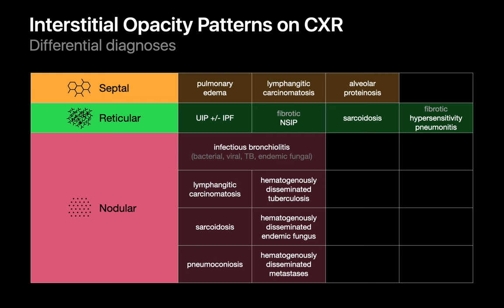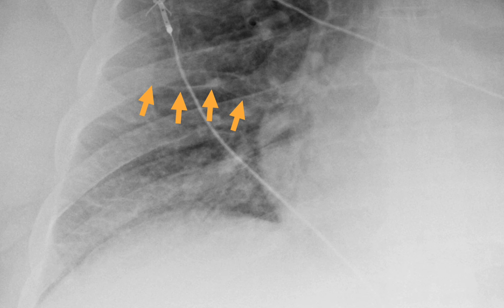Let's turn our attention to septal patterns of interstitial thickening. On a chest x-ray, the three-dimensional thick-walled polygons of the septal pattern may collapse into subtle lines discernible in some areas. We may see short one-to-two centimeter, one-to-three millimeter thin horizontal lines near the periphery of the lung, typically at the lung bases near the costophrenic angle, known as Kerley B lines. And we may see two-to-six centimeter thin radiating lines extending from the hilum in the middle or upper lung zones, known as Kerley A lines.